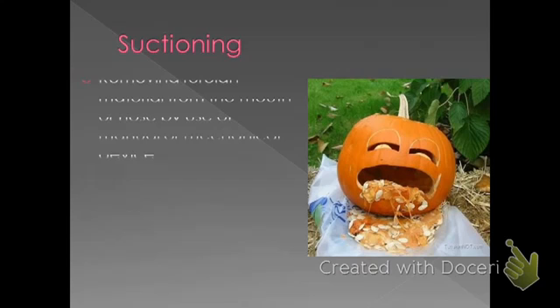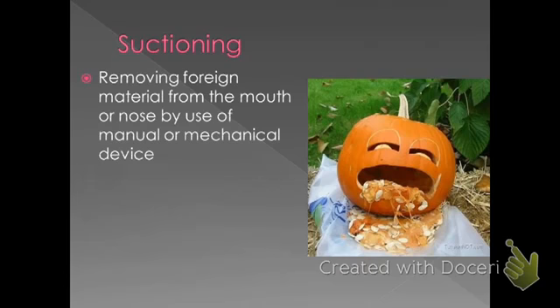One of the things I said is you can put them in the recovery position, and that works well. Sweep your finger through, clean the mouth out, and then you keep going with your artificial ventilations. However, there is another technique that you can use that does not involve you using your hands, and that is suctioning. Suctioning really is this idea that you're using some sort of device to basically remove foreign material from the mouth or nose of your victim.